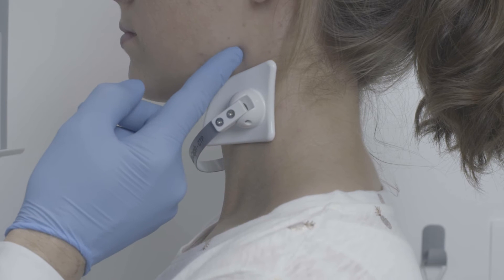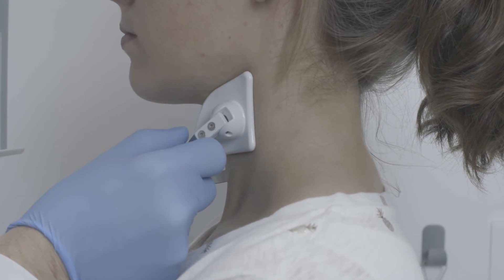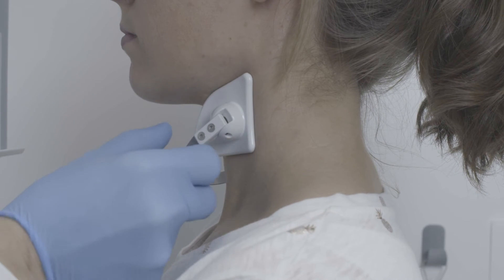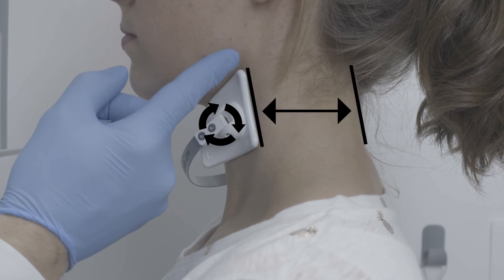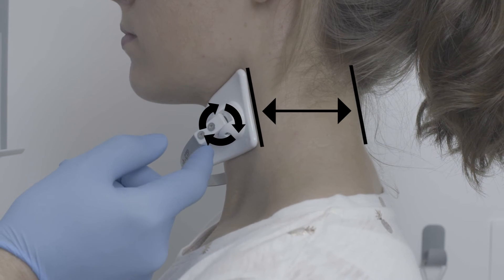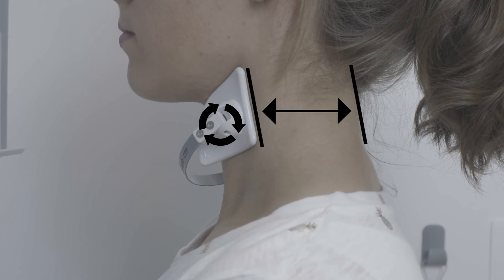To find the corner of the mandible we palpate with a finger. We place the upper corner of the shield just below the corner of the mandible. Now we must turn the shield in order to make the rear contour of the shield parallel to the rear contour of the neck of the patient.